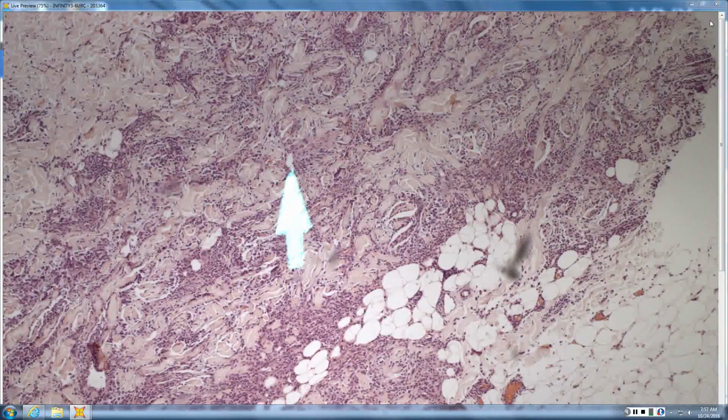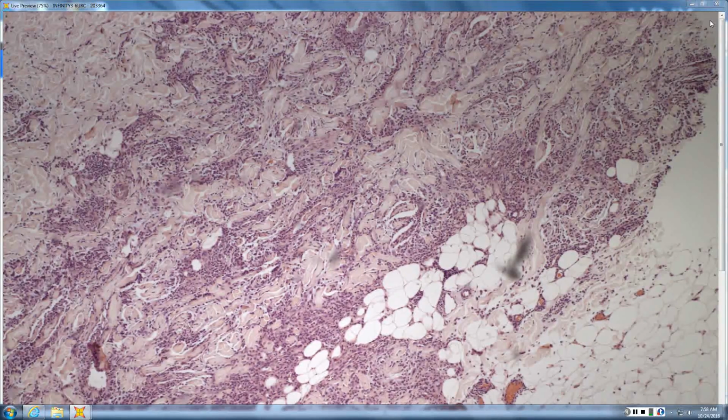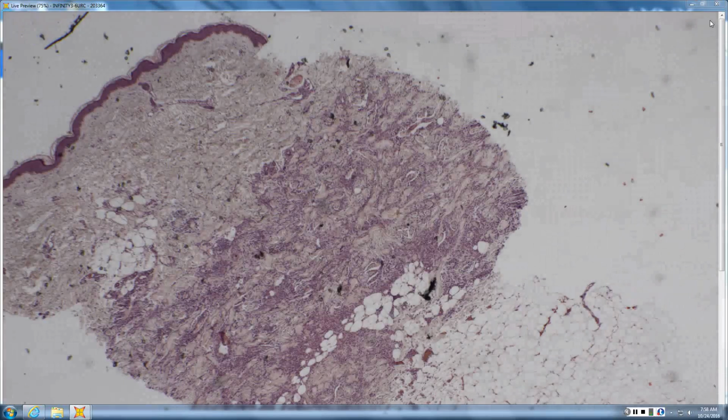So it's interstitial trapping collagen, and this patient came in because he thought he had been infested with a parasite. He'd been traveling, and now he has this thing that looks like a worm has crawled under his skin on his lateral thorax. And you see on biopsy interstitial granulomatous dermatitis. So what's the name of the condition? Interstitial granulomatous dermatitis. Yeah, IGD, right? So that's what IGD is. That's a classic presentation of IGD.